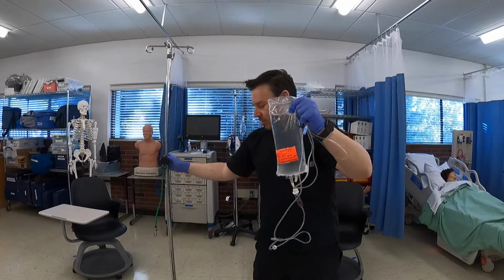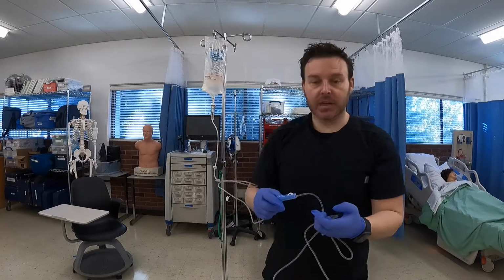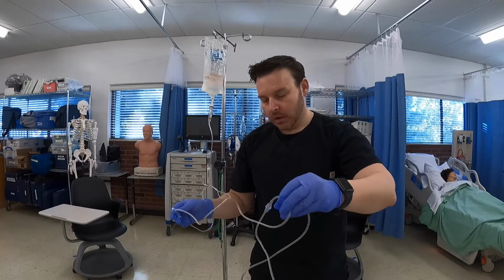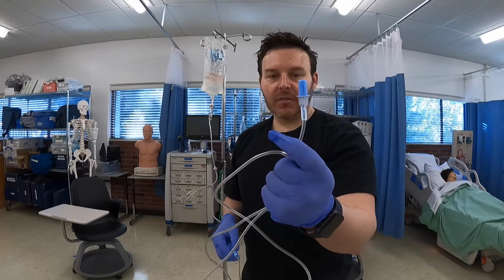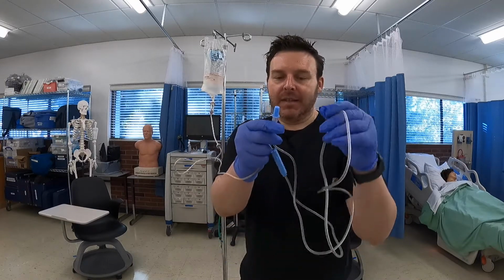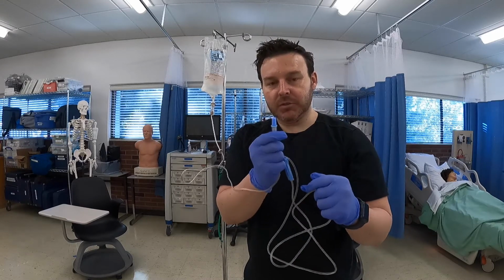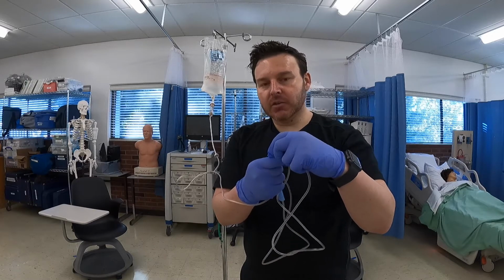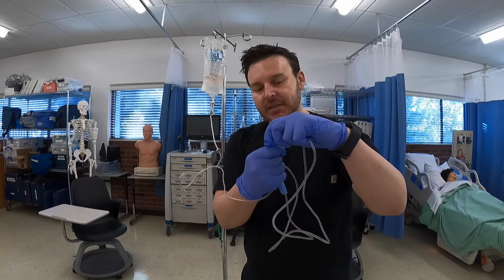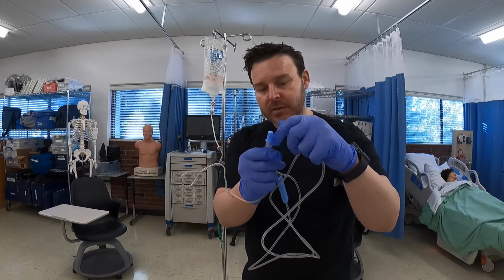At this point, I like to utilize, and this can be done in the patient's room, or it can be done in your medication preparation room as well. So the very end of your IV tubing, you have this little blue cap. I tend to leave it on because we want to keep that portion, which is going to be hooked up to the patient, as clean as possible. But to let a little bit of liquid out while we're priming this, I just twist it a little bit so it's a little bit open. That was a little too much, but now it's open.